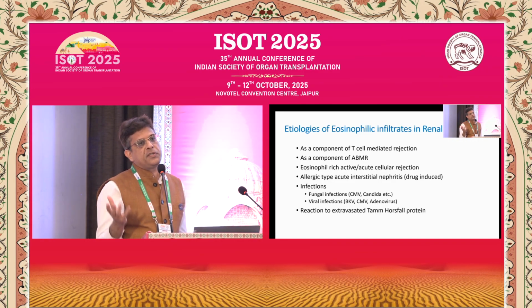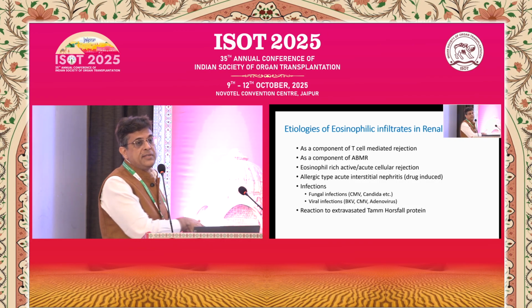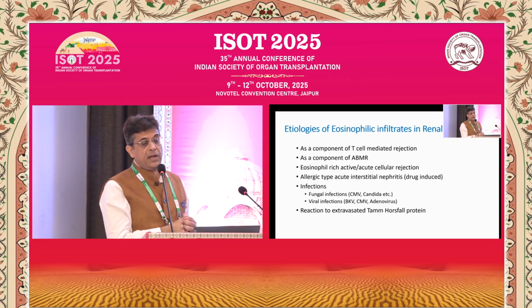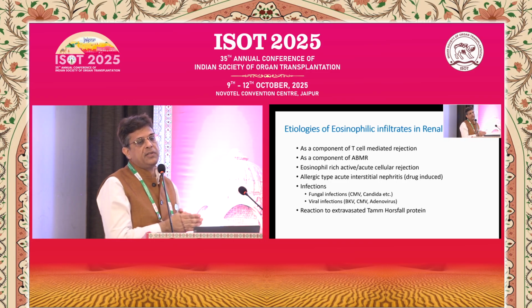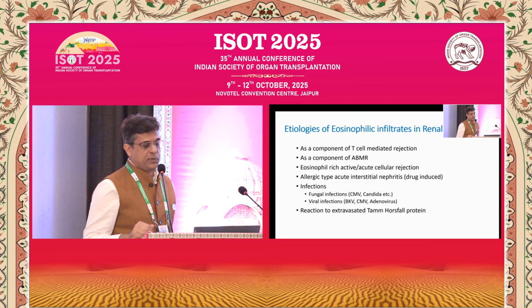So an allergic interstitial nephritis sometimes may become very difficult to distinguish from a classical interstitial nephritis, and probably I have a case to show you on that and how you can distinguish an interstitial nephritis from a rejection in an allograft, and all of us know what the implications are in terms of treatment.